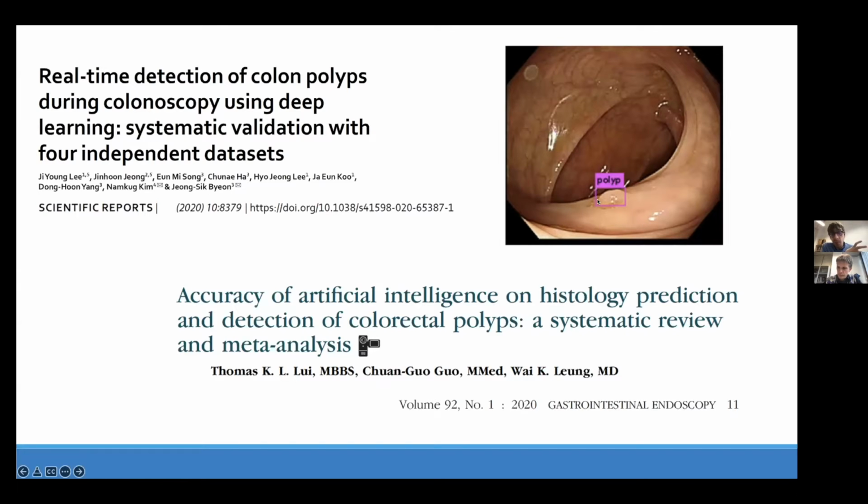It's very small in most cases, and it's not so easy for the endoscopist to identify these kinds of lesions. You have to consider that an endoscopy lasts just 15 minutes, and you have to see practically meters of tissue. So this is a first example.